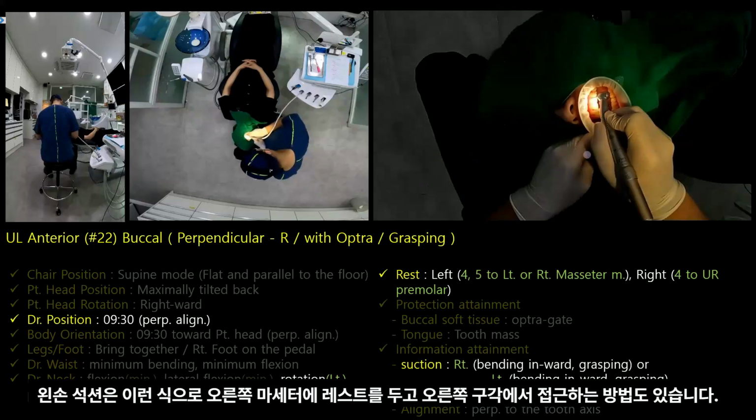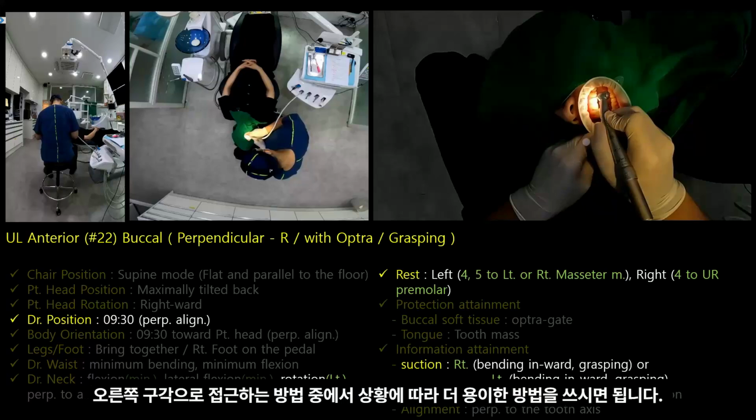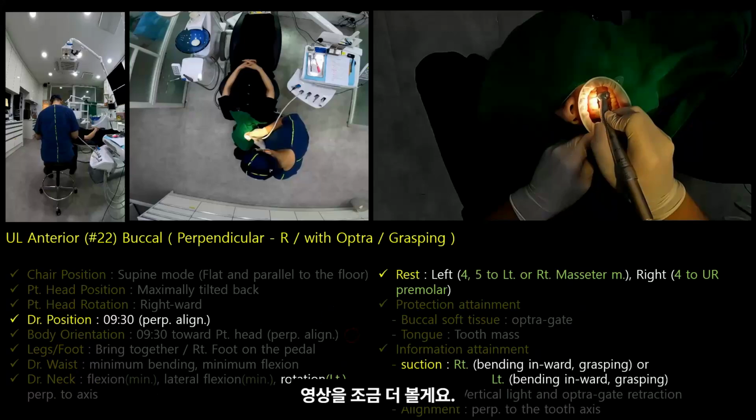Another method for left-hand suction involves placing a rest on the right masseter muscle and approaching from the right oral angle. Depending on the situation, you can use the more convenient method, whether approaching from the left oral angle or the right oral angle. Let's watch more of the video.